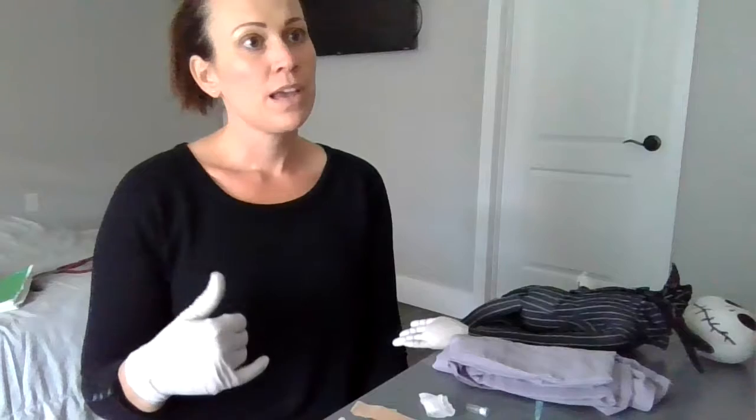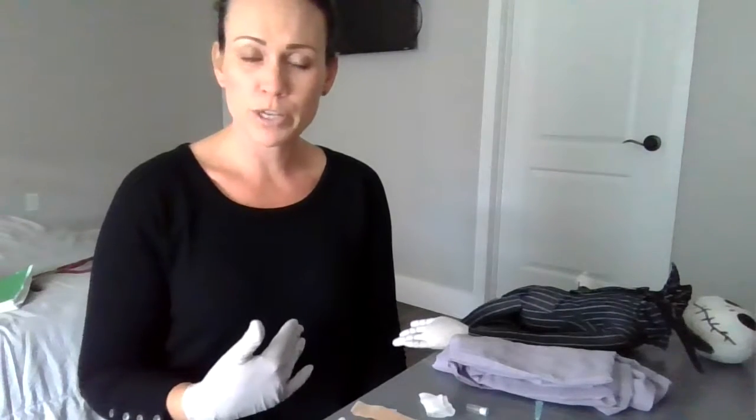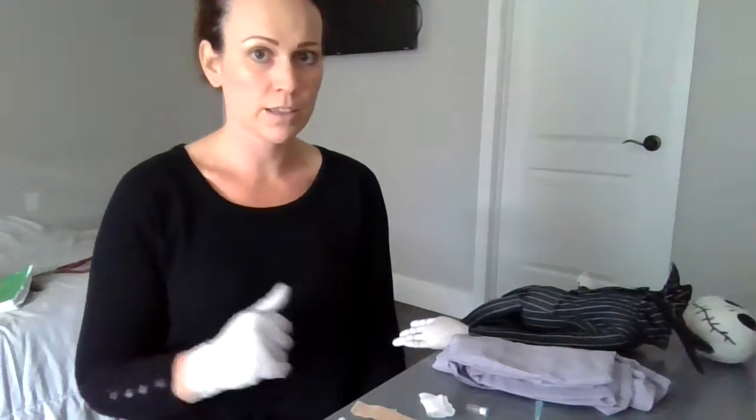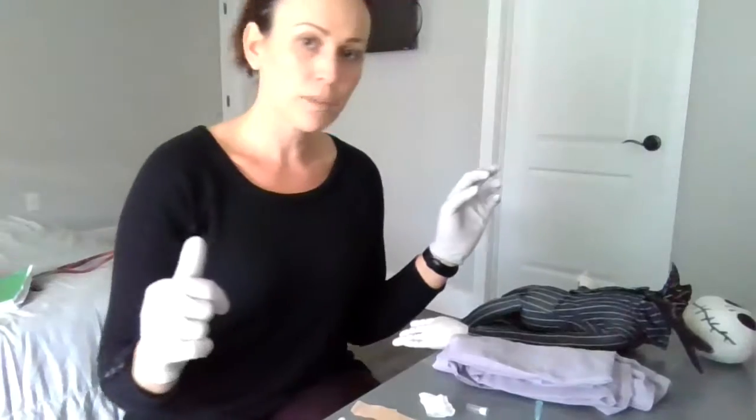Okay, first thing for the ABG draw, what I'm going to do is look at the patient's chart, make sure that the doctor has already put an order in for it, and then collect my supplies and go ahead and enter. When I'm looking at the patient's chart as well, I'm going to look at their history, check their medications to make sure they're not on any blood thinners or anything like that, because that will make a little bit of a difference when we go in to take the blood sample.